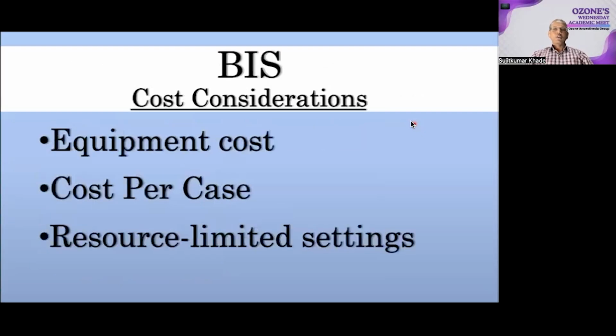A BIS monitor costs around 3 to 3.5 lakhs in India. The disposable BIS electrodes cost around 1500 to 2000 rupees. So awareness is rare. Therefore, in low income or resource limited settings like many hospitals in India, the high cost of BIS equipment is a barrier. Instead, maintaining adequate volatile anesthetic dosing and using simpler monitors like capnography and the MAC alarms may be more realistic.